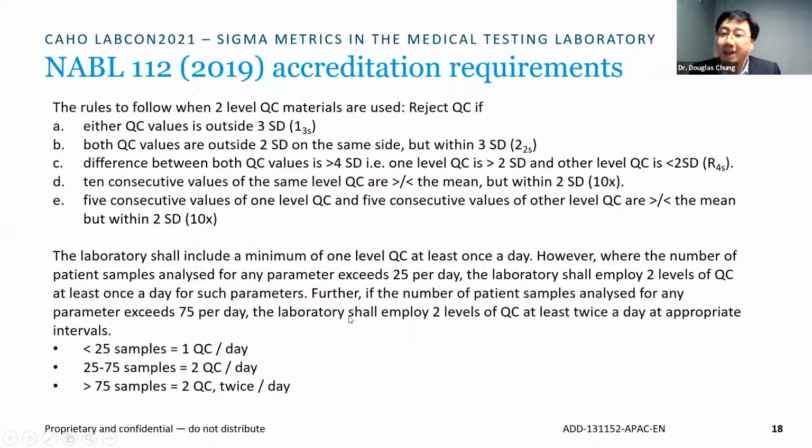In India, we know that we have the NABL guidelines, right? So NABL is very prescriptive when it comes to which rules to use, as well as what the frequency is, right? I think all of you in the audience are very well familiar with the NABL requirements, right? They're not yet harmonized to the latest CLSI recommendations, but we'll see what happens in the future.